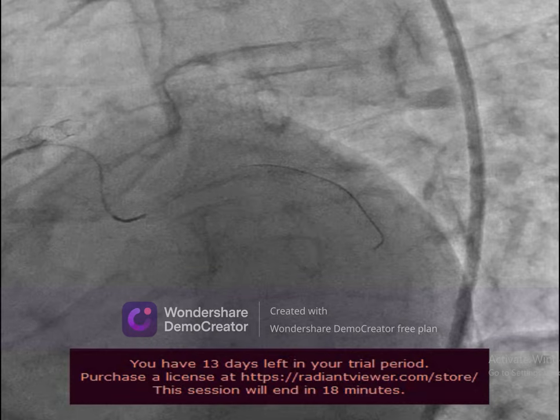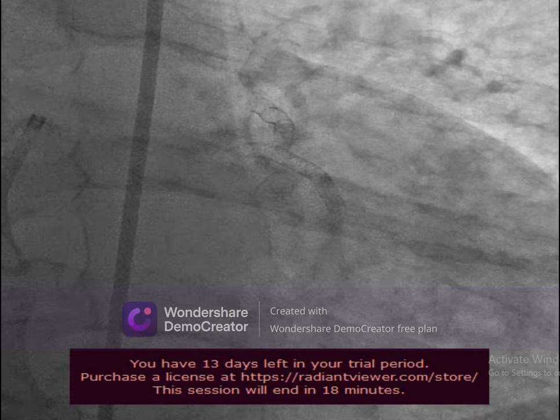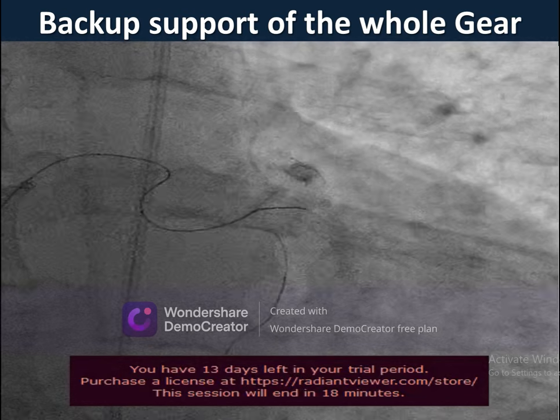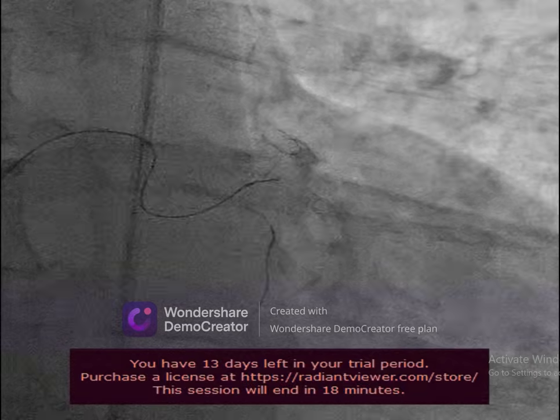I tried to push the microcatheter, but as you see here, it doesn't go, and unfortunately the whole system buckled. So at that time I realized that I needed more support, and there are different kinds of anchoring. But I started first with just passing a wire in the LCX proper to the distal LCX, and I tried to take the Pilot 200 again to navigate through this in-stent restenosis.